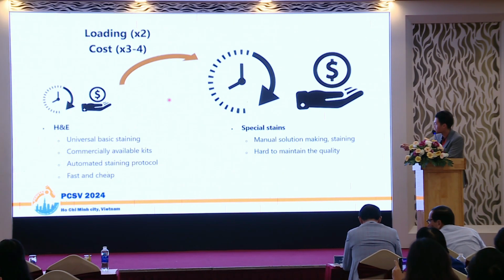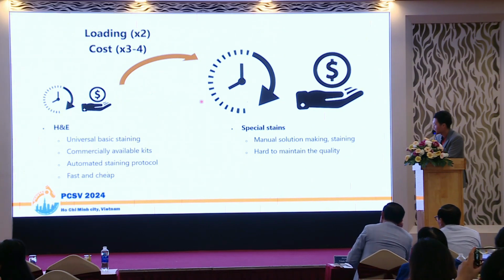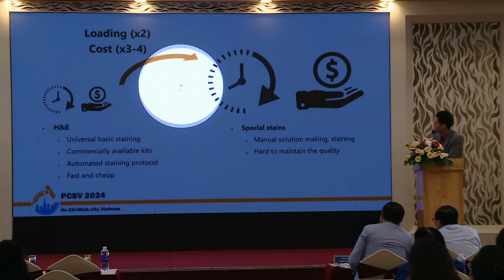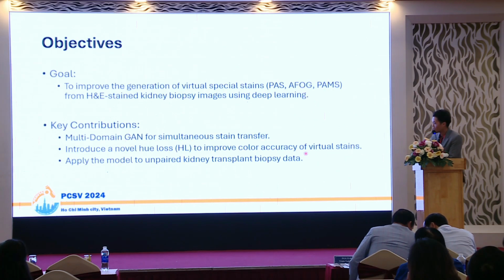Other challenges include the special stains, because although H&E stain is usually automated, cheap and fast, special stains are usually more expensive, take more time, or are hard to maintain in quality. So I guess stain transfer could help this situation.